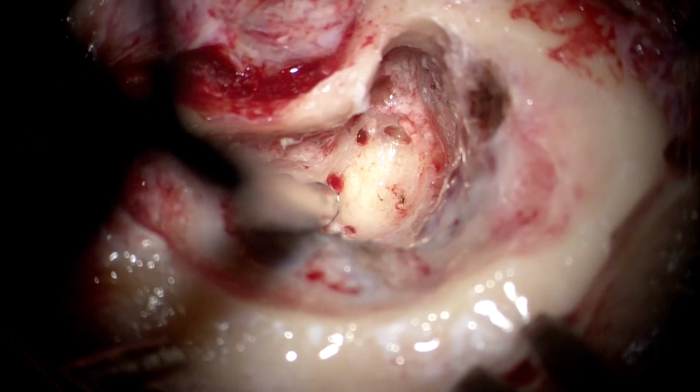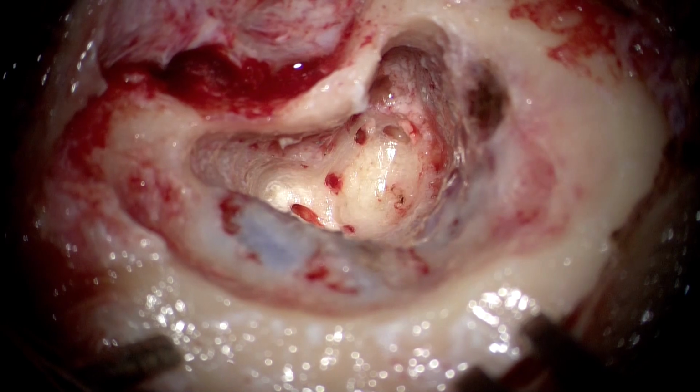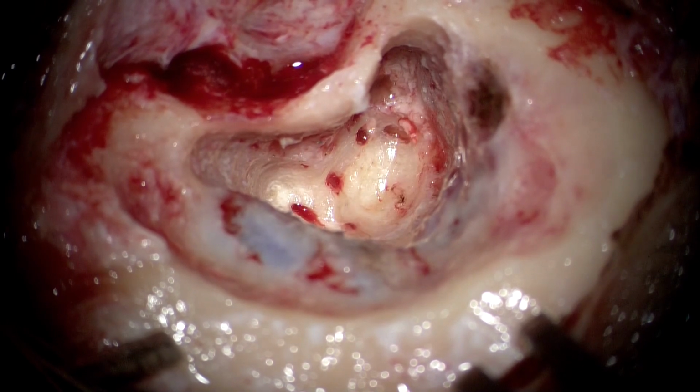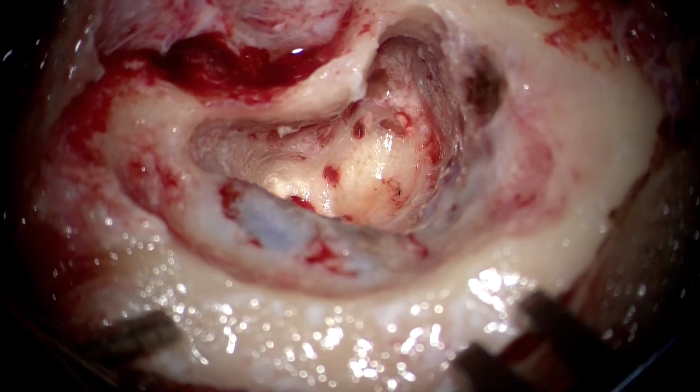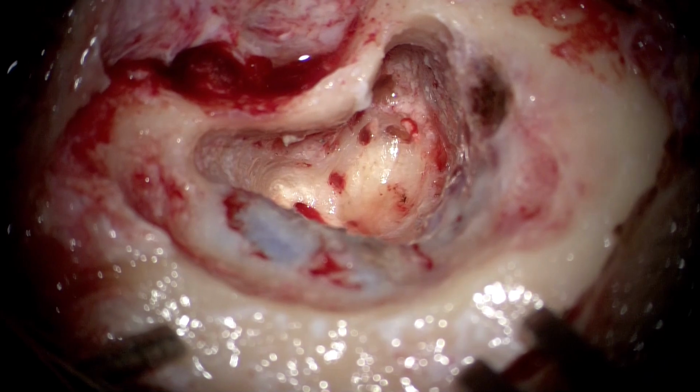We can now see that the superior canal portion has also been opened. We can see here how the posterior canal, the lateral canal, and the superior canal, all three have been opened partially, though not completely, right now. Our superior limit of drilling in this procedure of transmastoid labyrinthectomy is the superior canal ampulla.